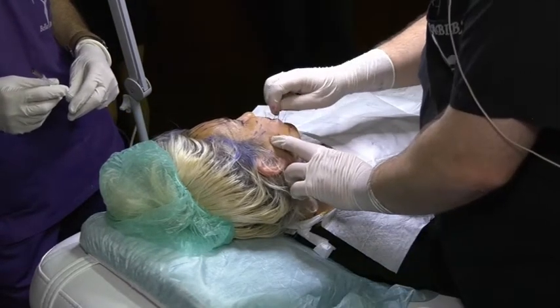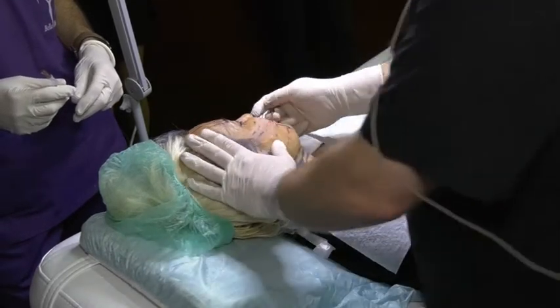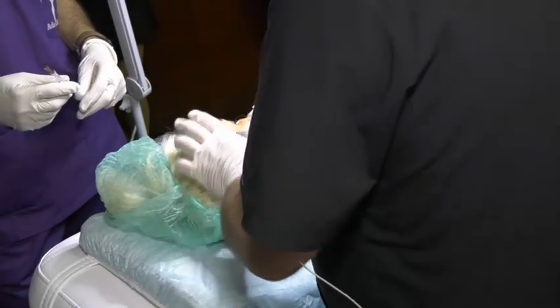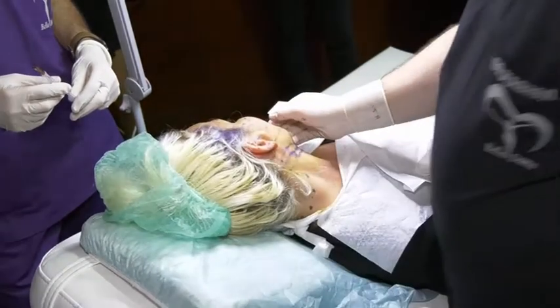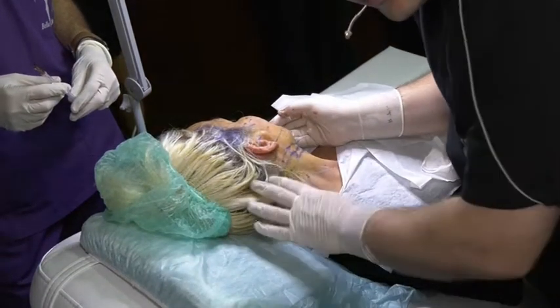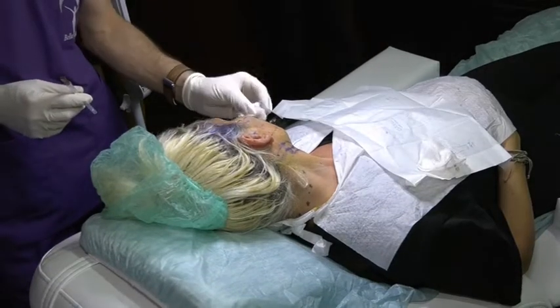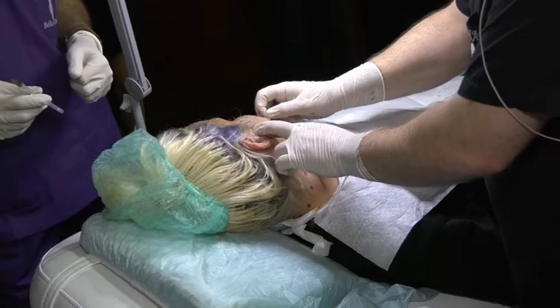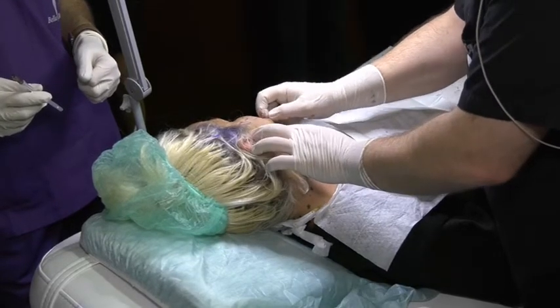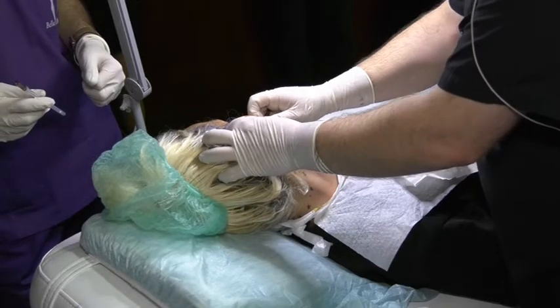Start stage 3. Press and lift up. Press and lift up. Okay? You can press like that. You can press with the big finger. Okay? Look, I am here. You see? Still I have around 1 kilometer to drive. Don't stop here. No result. You have to drive more. Press good. And then you lift up and push. You here. Last few millimeters. Then finish. Okay?